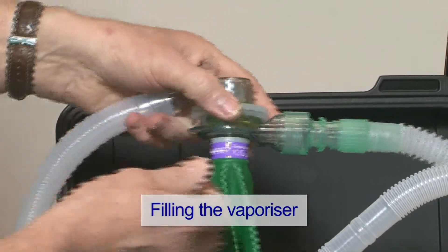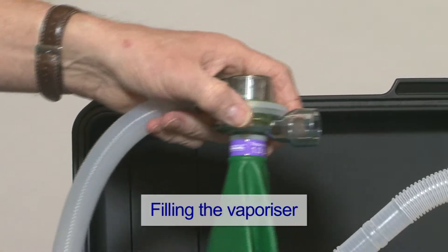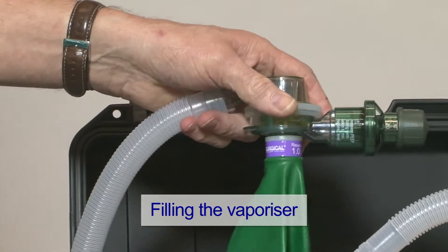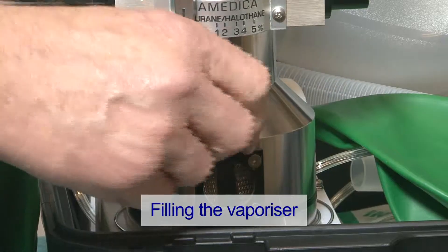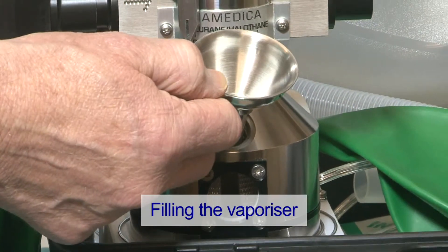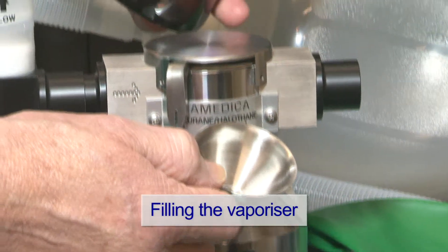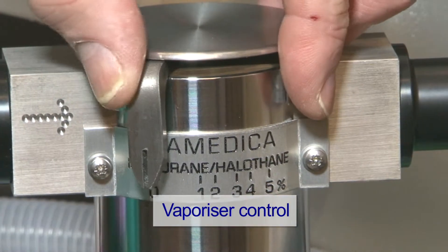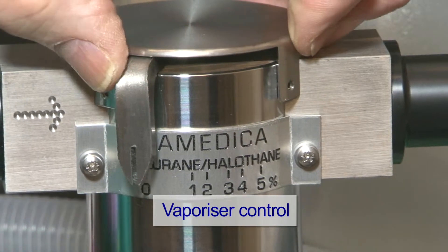PEEP can also be supplied in the same way. The vaporizer is suitable for isoflurane or halothane and is filled by removing the cap and using the funnel supplied. The anesthetic agent output is controlled by moving the lever on the front of the vaporizer.